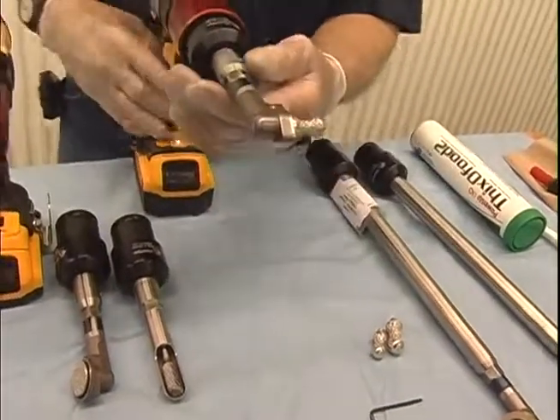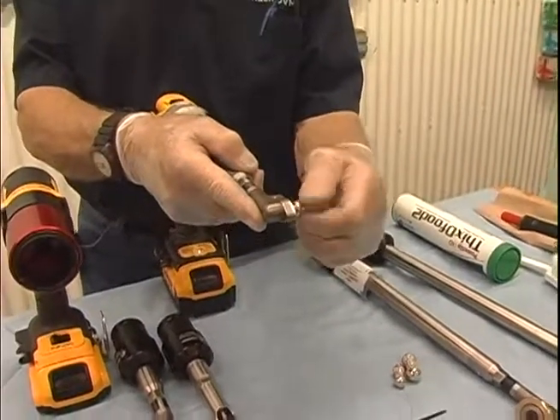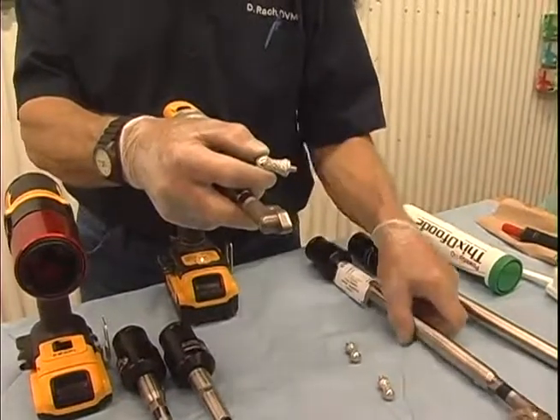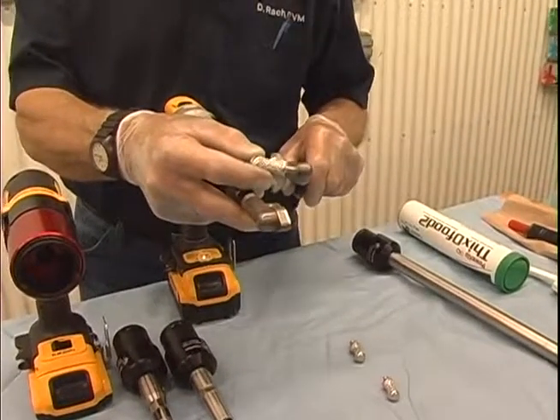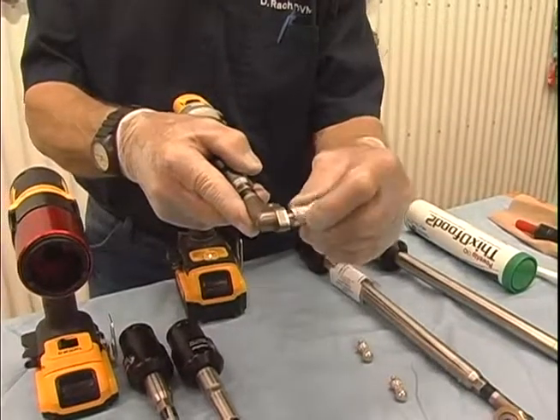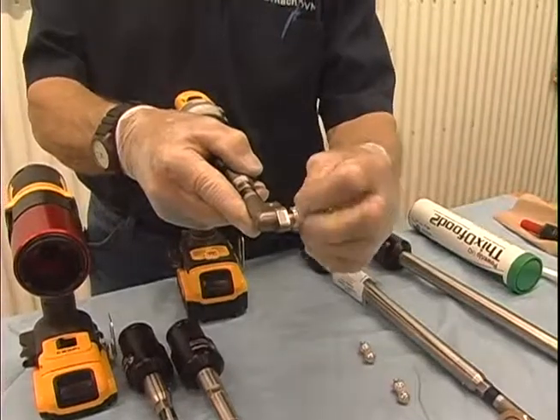apple core burr. There are some people who prefer a larger apple core burr, and this can be put on this long shaft if you wish at the back, for the back of the mouth, or it can be put on this shaft for doing bit seats.